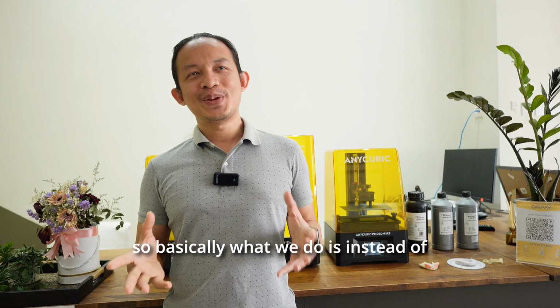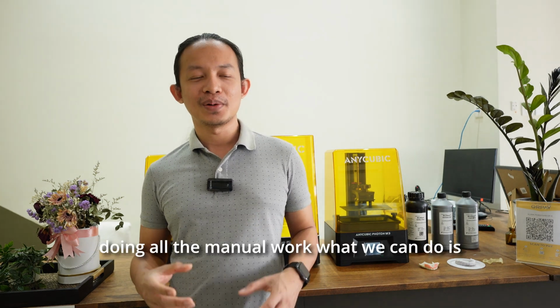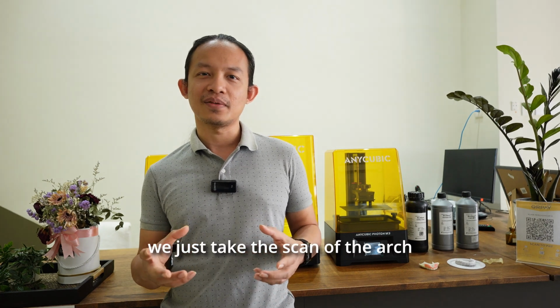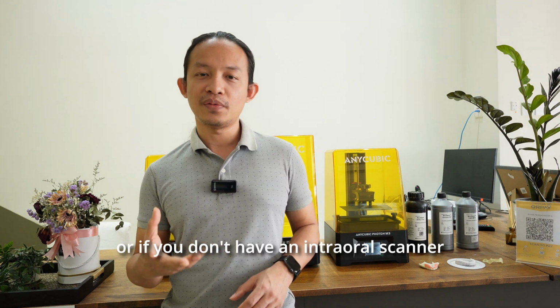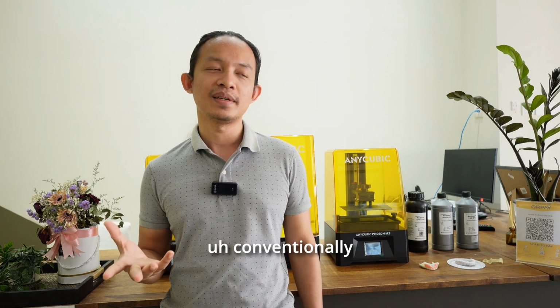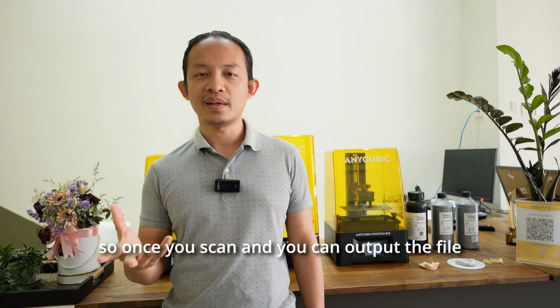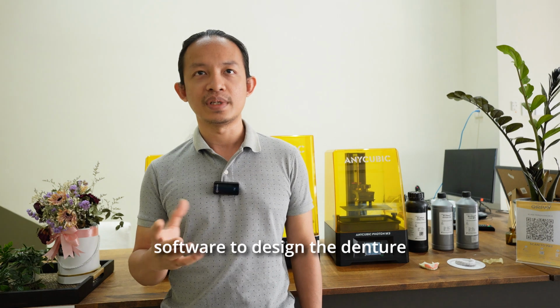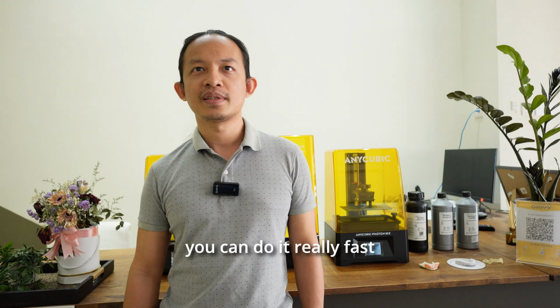So basically what we do is instead of sending the case out to a lab, doing all the manual work, we just take the scan of the arch in the patient, either with the intraoral scanner, or if you don't have an intraoral scanner, you can just take an impression conventionally, pour them into a cast, then you can actually scan them. So once you scan, then you can output the file, which we can manipulate in the software to design the denture. I would say the main benefit is you can do it really fast.